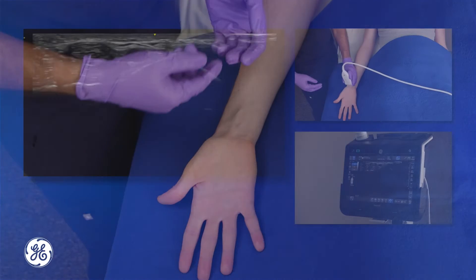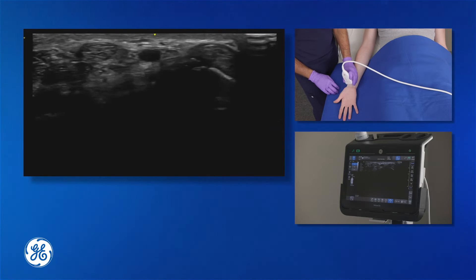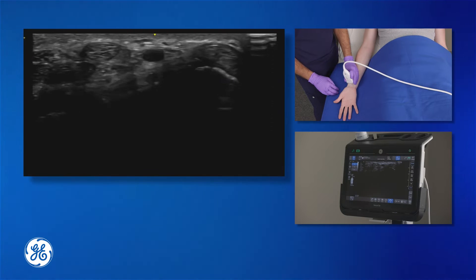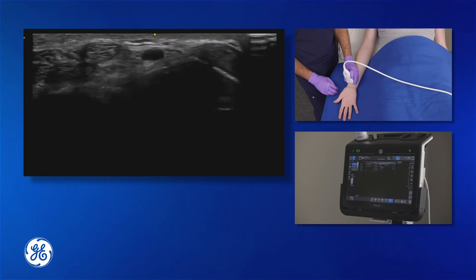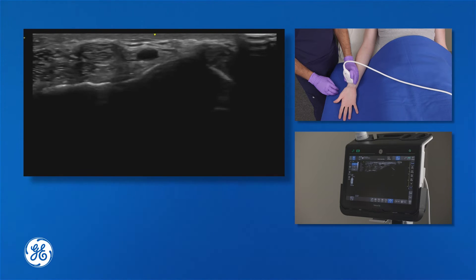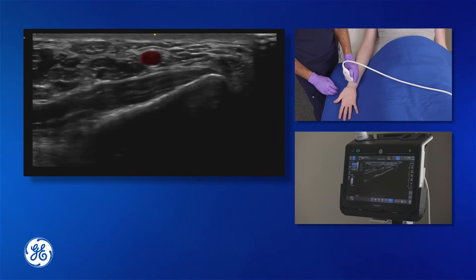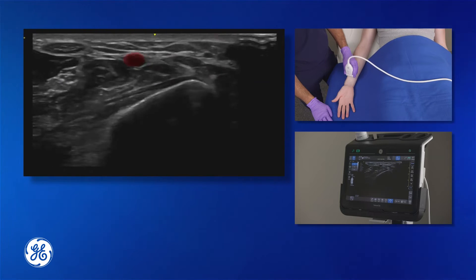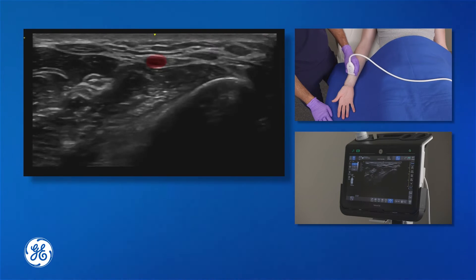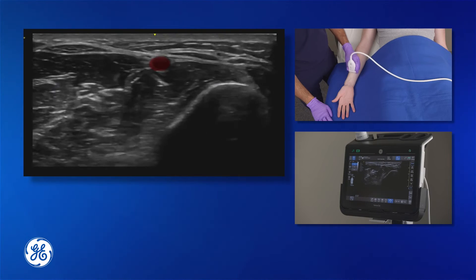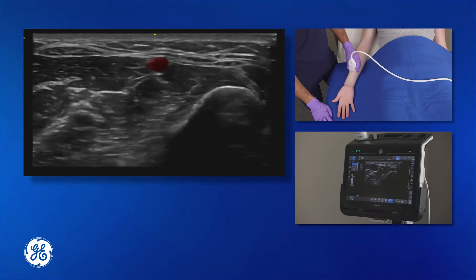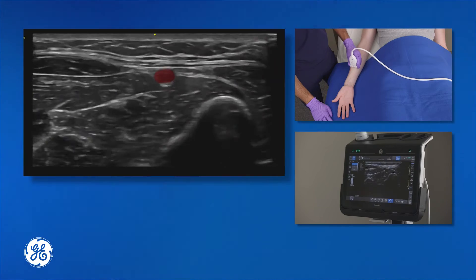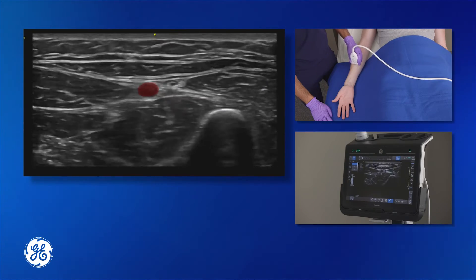However, with an ultrasound, what we can do is try to find the radial nerve by following the radial artery. Here you can see in the center of the screen the radial artery, and we're going to track the radial artery proximally, maintaining a view on it. As we look at the radial artery, eventually the radial nerve will track adjacent to the radial artery and be visualized.